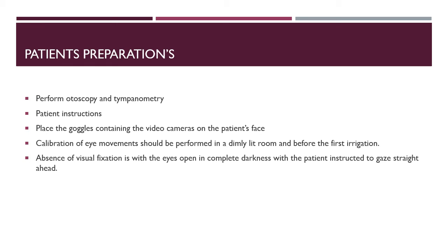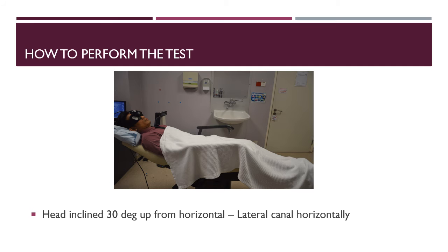So the optimal condition for recording caloric induced nystagmus is in the absence of visual fixation, with the eyes open in complete darkness, with the patient instructed to gaze straight ahead. So before we start with the irrigation, we switch off the lights. Okay, now let's move to the next slide.